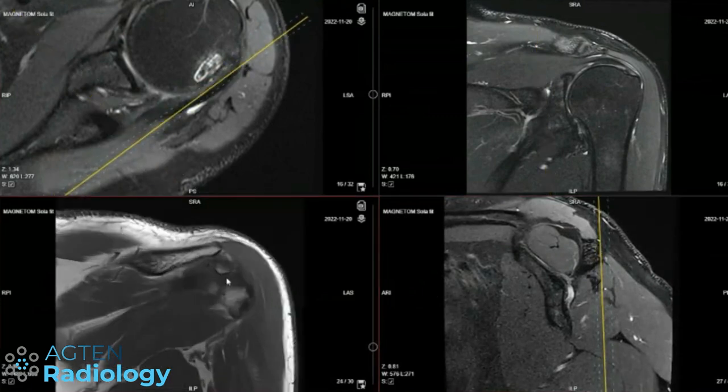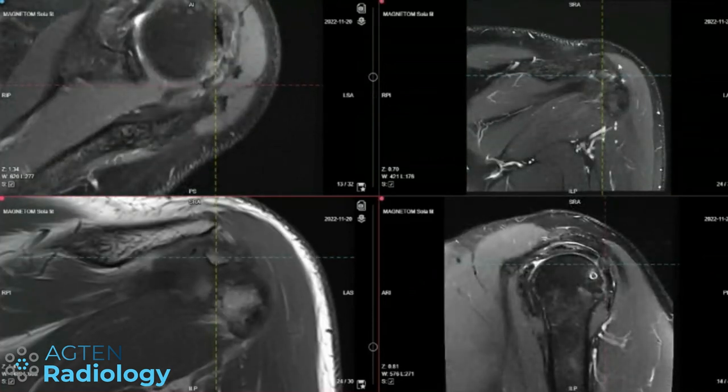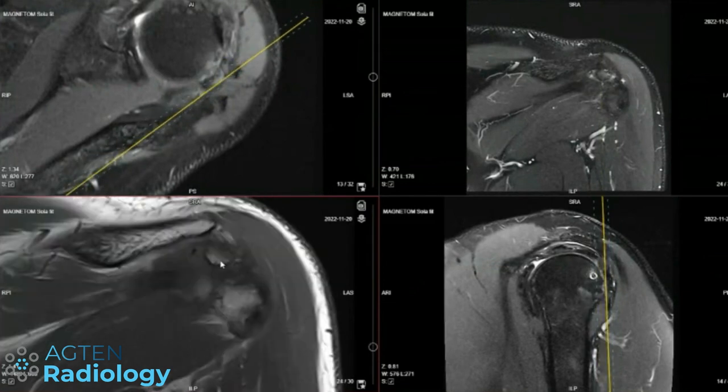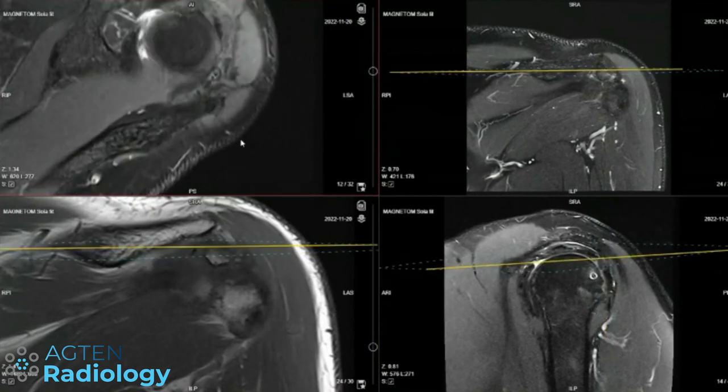Looking at this area here, it's fat saturated — so it's a fat-sat sequence. It's mature bone. Whether it's heterotopic ossification — do you have any prior imaging? There's also a pre-op study for comparison.